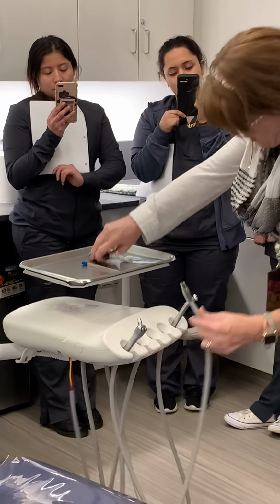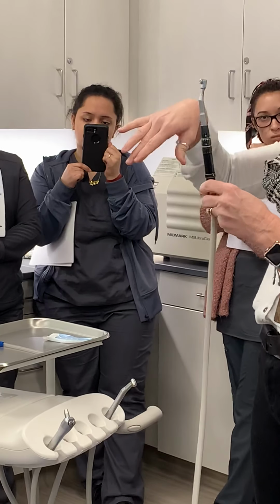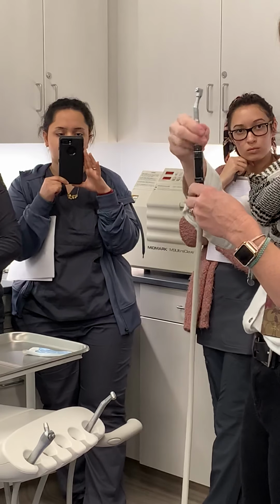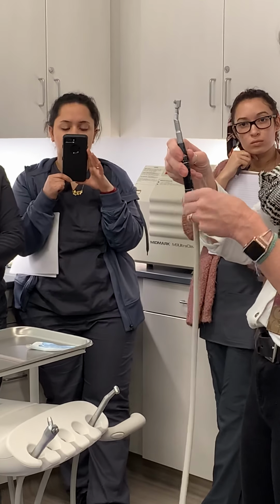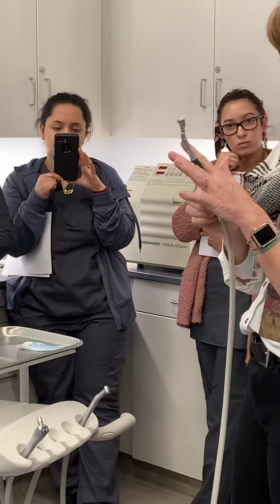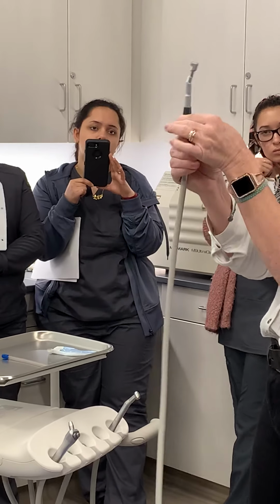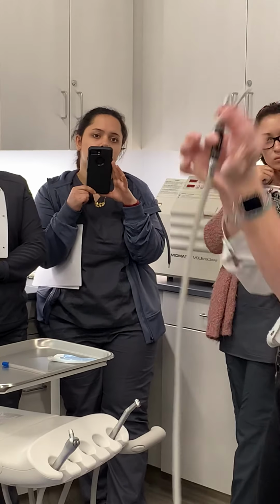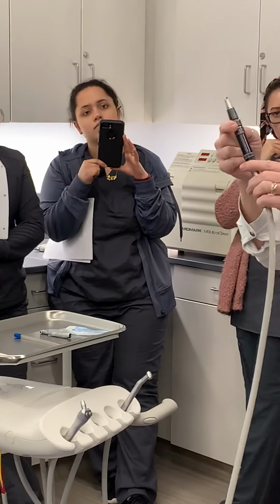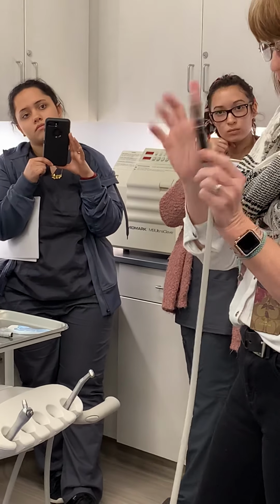Then you have next, you have the slow speed contra-angle handpiece. So speed is its first name, shape is its middle name, handpiece is its last name. So if you think of it like that, you're naming, okay? So slow speed contra-angle handpiece can be used by both assistant and doctor inside the mouth, never with water. If we take off the attachment, then we have the slow speed straight handpiece used outside of the mouth for adjusting anything made out of acrylic, used by both doctor and assistant, no water.